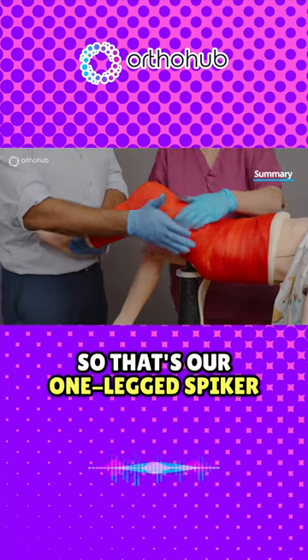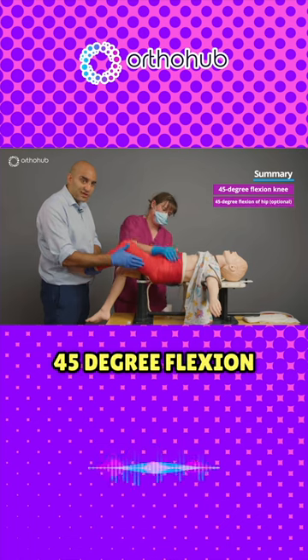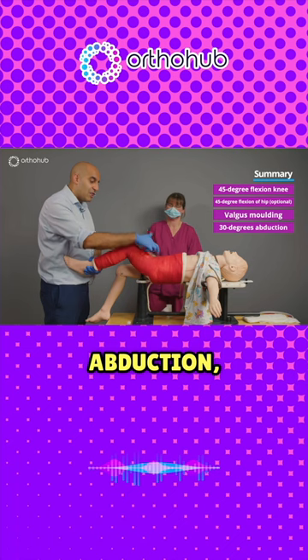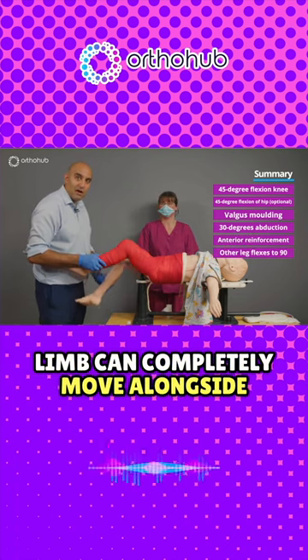There we have it. So that's our one-legged spica cast: 45 degrees of flexion in the knee, 45 degrees of flexion at the hip, valgus molding at the fracture site, 30 degrees of abduction, reinforced at the front — and the contralateral limb can completely move alongside with it.